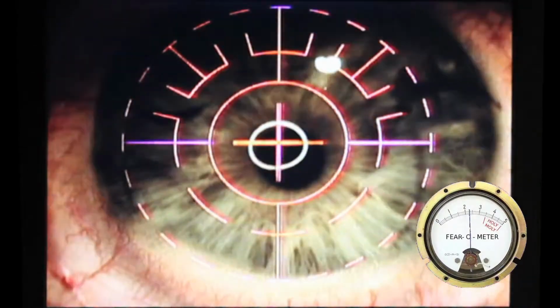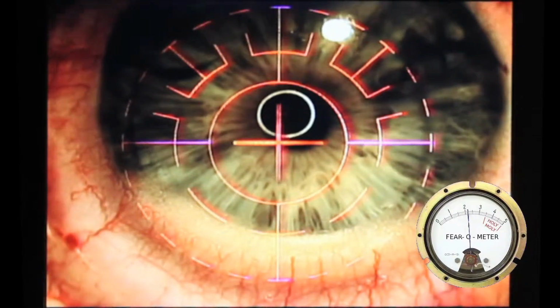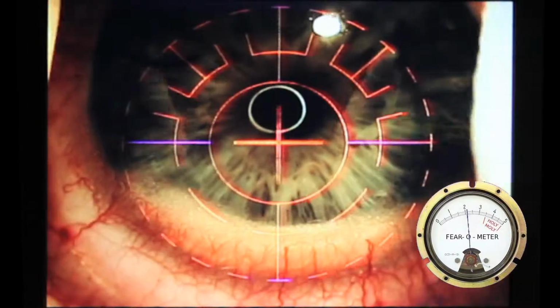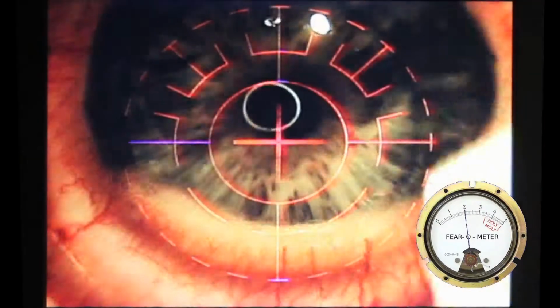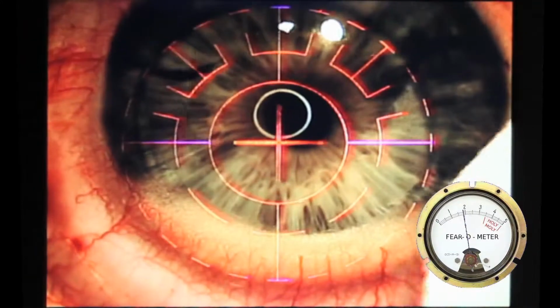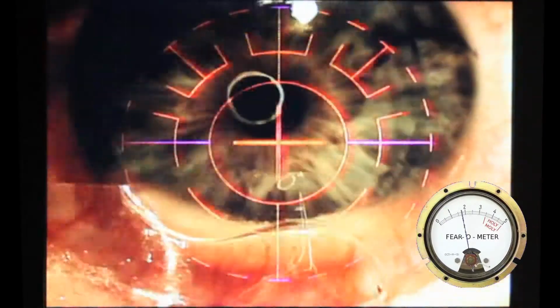So they put a drop of water back on, and they laid the flap back over, and he said that the van der Waals forces will keep it in place there, which is some type of vacuum forces that apply on contact surfaces. And then he rakes your flap back and then puts it back in place ever so gently, and then you go to the other eye.